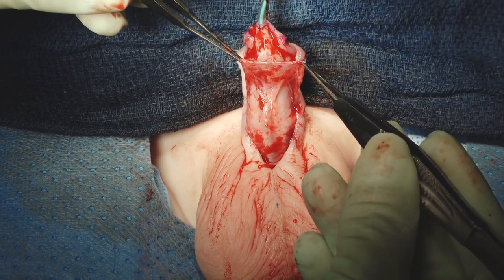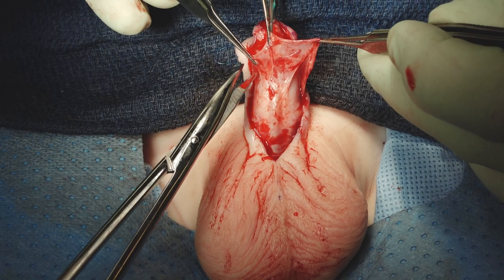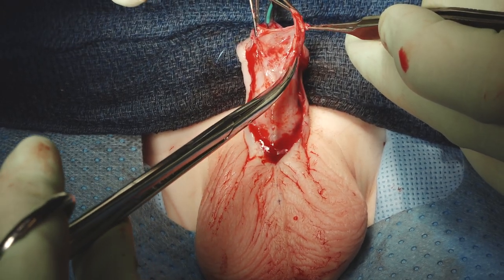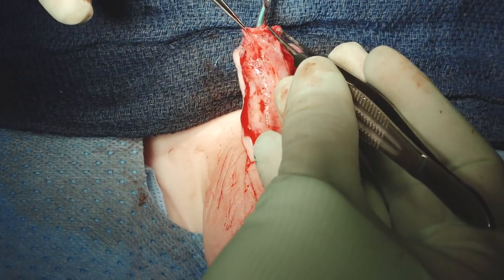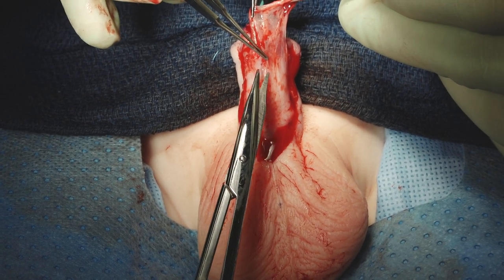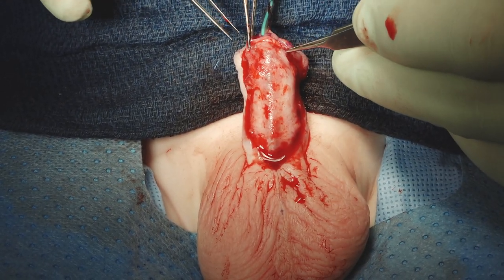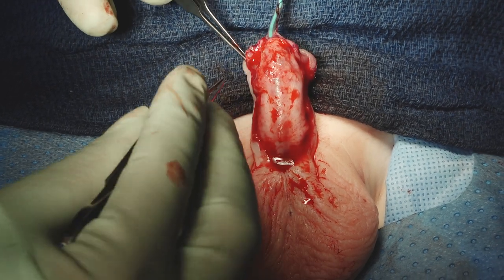Now we're going to finish making this ventral dartos flap to cover things. You obviously could make this from dorsal tissue, but then you'd have to take down all this retraction, go up there and get it, bring it down, and set it all back up again — even if you degloved completely at the beginning. We just find this is easier and quicker. You can feel these little tension bands right in this region. Now there is absolutely zero tension on this — you can see that it's lax. We'll tack that into place.